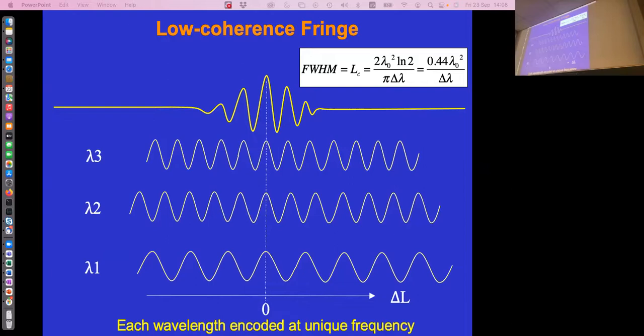And this is exactly like adding up sound waves, which we're doing at the top. But there's one very important thing for this pulse pattern to repeat, and that is in your source, you need a certain distribution of intensities. So I can take a source and draw a graph here of the intensity. This is the intensity that I have, and this is wavelength. Basically this is a Gaussian shaped source. If I look at this source, it will never repeat. But if I look at this source, it's now not a continuous Gaussian, but a picket fence. If I use this source, the pattern will repeat.